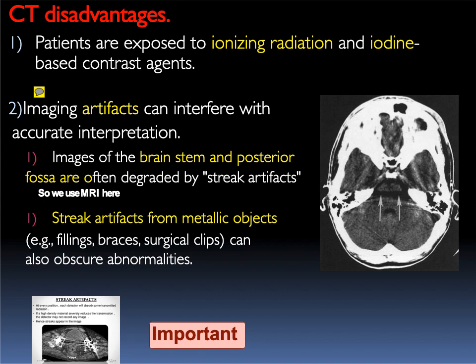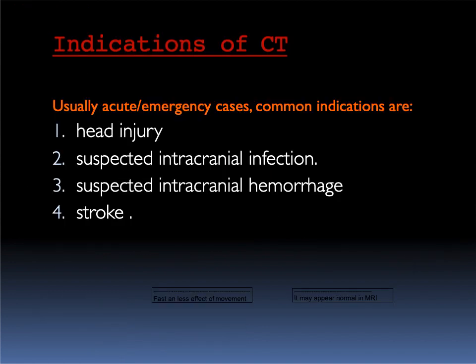Amalgam or metallic fillings give you streak artifacts, metallic artifacts. Surgical clips can also produce artifacts that interfere with the detection. Even in the lumbosacral region, screws after surgery can cause artifacts. They may obscure the abnormalities. Although it's not common, but sometimes.